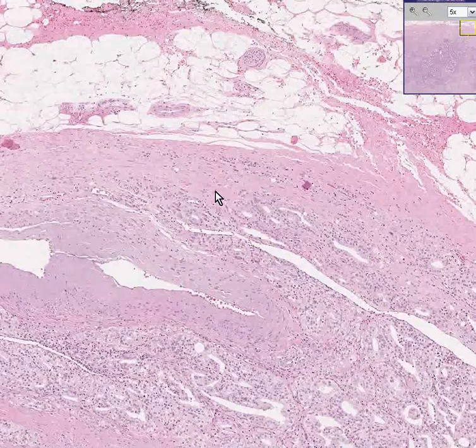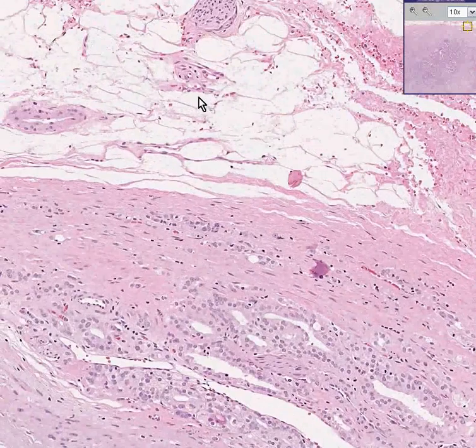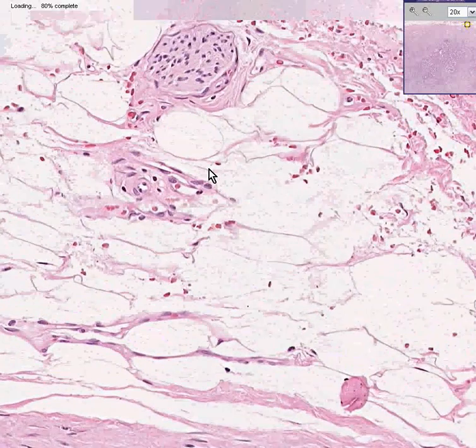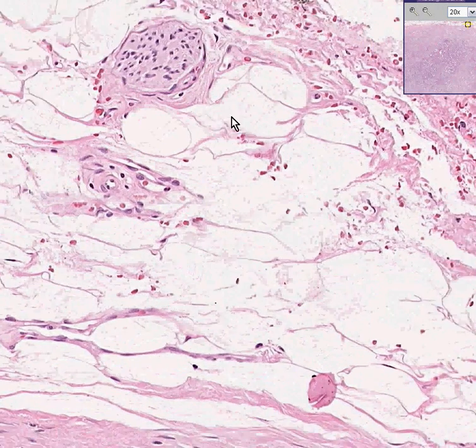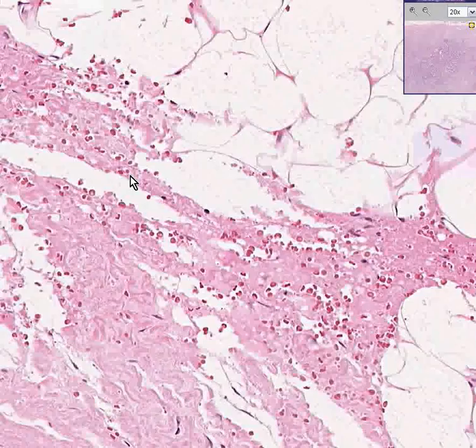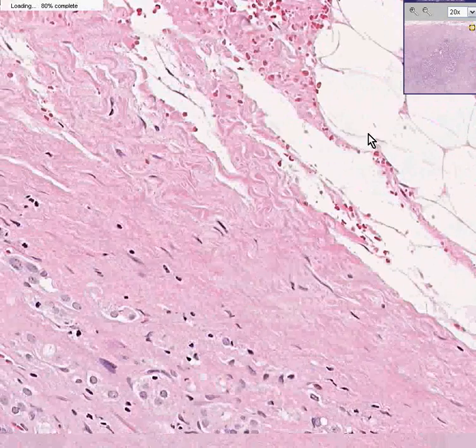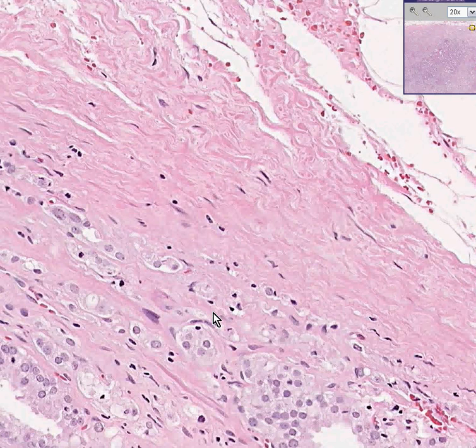I want to point something out here. You see these nerves? Sometimes when you're looking at a very difficult prostate, the only way you could tell that it's cancer is that there are little glands surrounding the nerve in this little perineural space here. This nerve doesn't have glands. But one thing that pathologists always do is look at these little nerves that surround the prostate beyond the capsule and the fat. And if they have little tumor cells like you see here in the capsule, they call it perineural invasion.